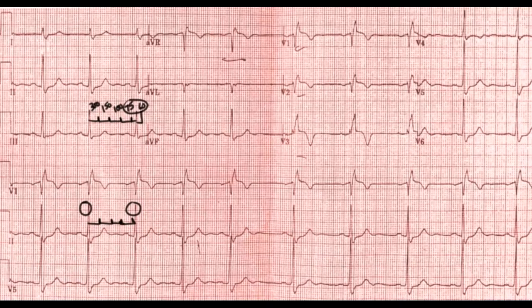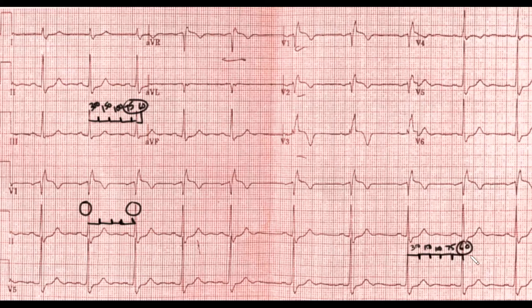Remember our count: the first box is 300, the second is 150, the third is 100, the fourth is 75. So the rate falls somewhere between 60 and 75, giving us approximately 70 on one side of the strip. On the other side, counting five boxes gives us closer to 60.